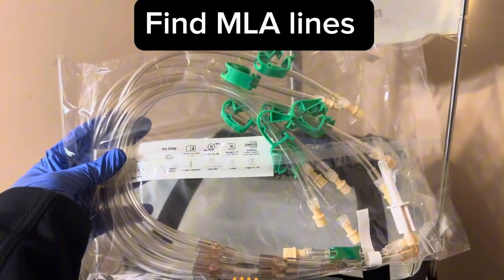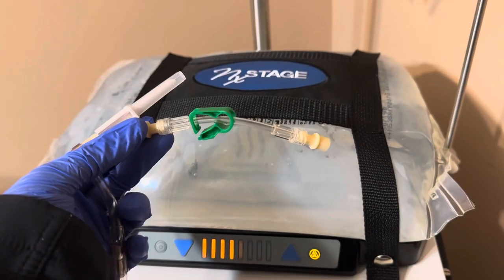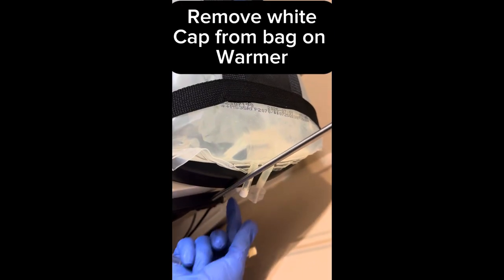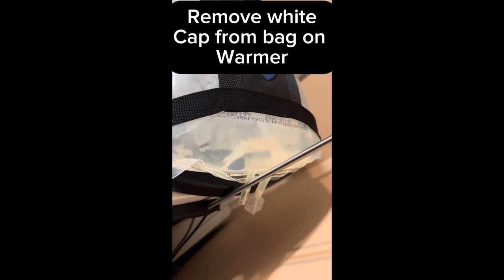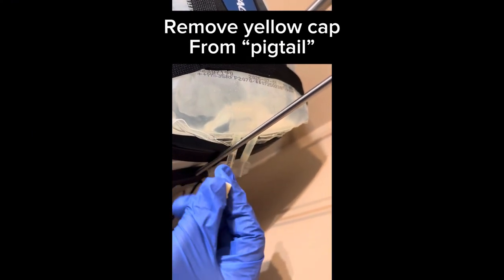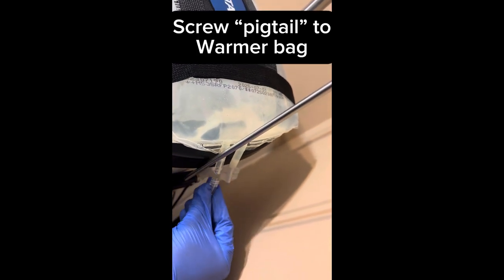Find the MLA lines and remove the paper tab. Find and hold the pigtail — the small green line. Remove the white cap from the bag on the warmer, then remove the yellow cap from the pigtail. Screw the pigtail to the warmer bag.